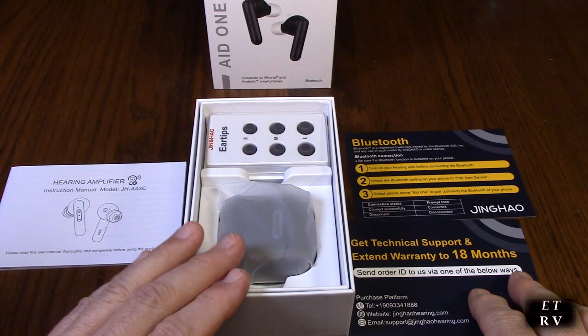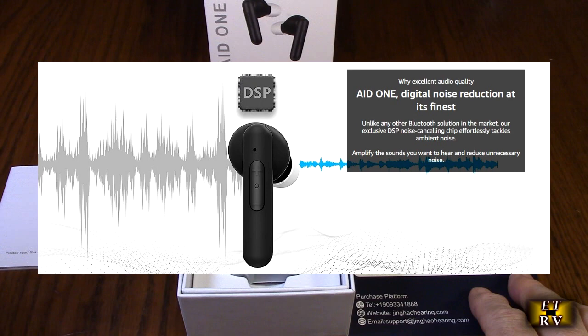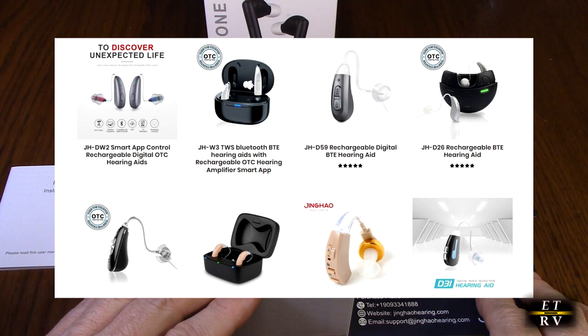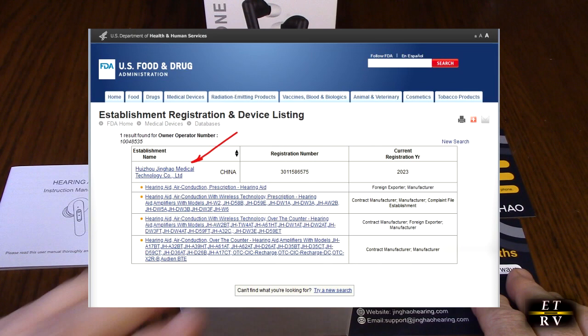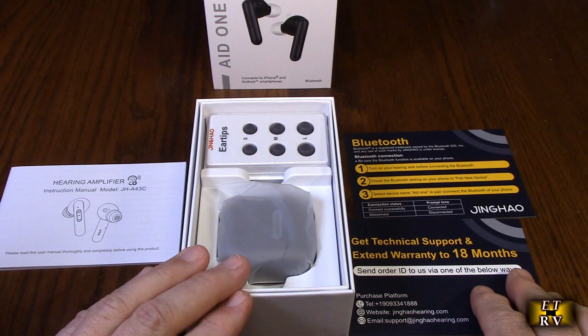It features four hearing modes to adapt to different usage scenarios. It's equipped with independent Bluetooth chips and digital sound processing chips, providing superior sound processing that most so-called Bluetooth hearing aids on the market do not have. The Jing Ho brand is well known in the hearing aid industry and has been selling hearing aids successfully for many years. The product has obtained FDA certification and is a genuine over-the-counter hearing aid — a new category that consumers can buy directly without visiting a hearing health professional. They're designed to help adults with perceived mild to moderate hearing loss.